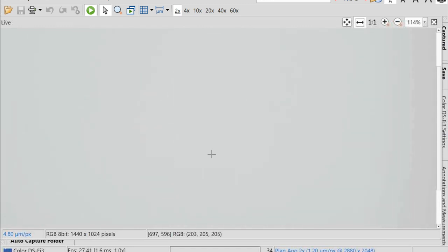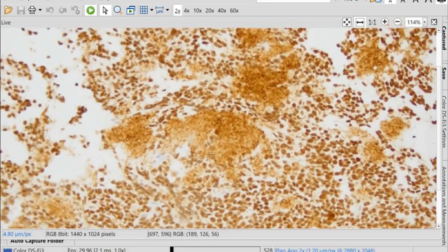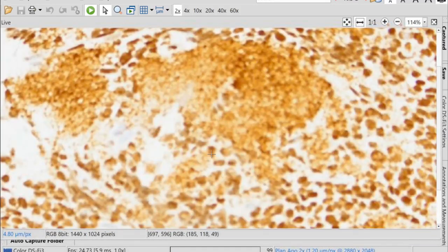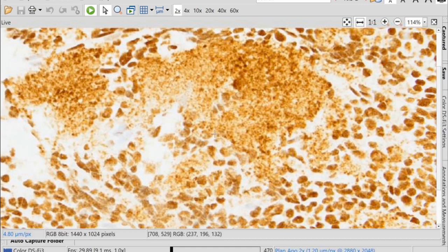Neurofilament protein staining showed abundant processes within the pinocytomatous rosettes. Neurofilament protein has been used by some groups in grading pineal parenchymal tumors: the idea is that more differentiated tumors preserve neurofilament protein-positive processes, a feature of well-differentiated cells including well-differentiated tumors in this region. The more processes present, the more differentiated the tumor. The tumor was also synaptophysin positive. These features are consistent with a well-differentiated pineal parenchymal tumor.